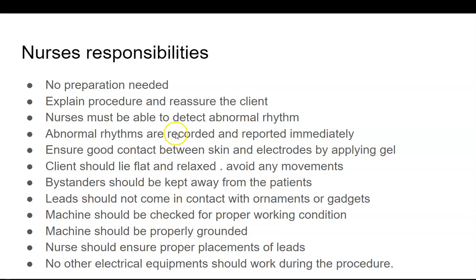And what is the nurse's role? The main thing is when you do an ECG, you should properly label it with date, time and the patient's identification and put it in the proper file. Before filing it, make sure that someone has seen the ECG, either the senior nurse or the doctor, to make out whether there are any changes in the ECG. This is a very important practical aspect you should remember. Don't just act like a machine and put it in your file. Make sure that the changes have been noted by the doctors. Okay, thank you.